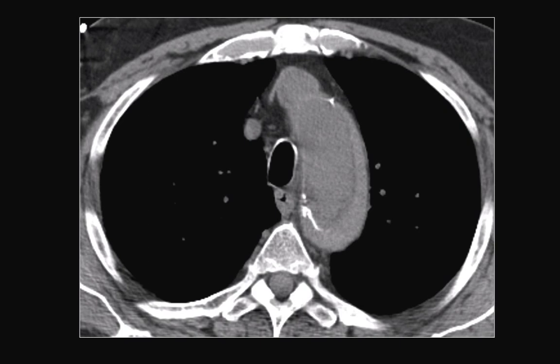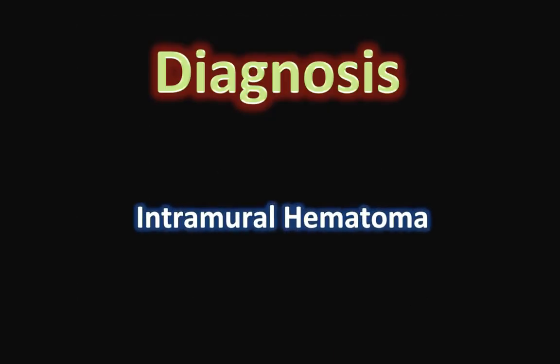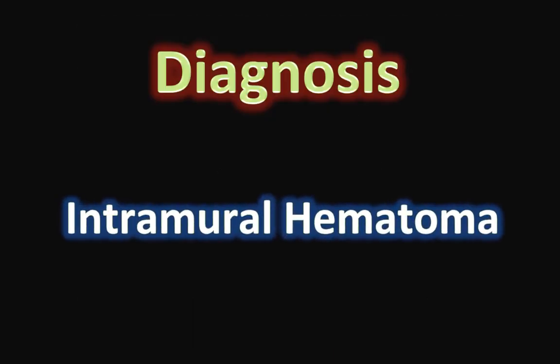This is a non-enhanced CT scan showing medial displacement of the intimal calcifications. What was seen on the contrast-enhanced image as a peripheral hypodense rim appears as a peripheral hyperdense rim on this non-enhanced image. This concludes the diagnosis as intramural hematoma.